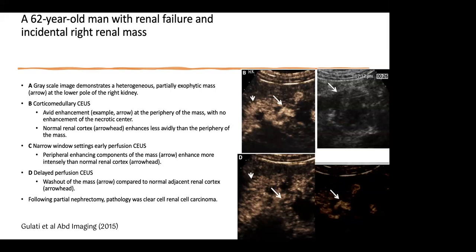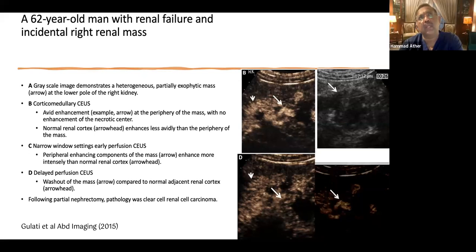I think it is very well defined, and I totally agree with this. It is the differential. We use these terms, attenuation in the appearance, or the different attenuation in different phases of the study, that makes the lesion which we are suspecting stronger to be a real lesion versus a pseudo lesion. So can you say a few words about the time intensity curves and their value in this contrast enhanced ultrasound?